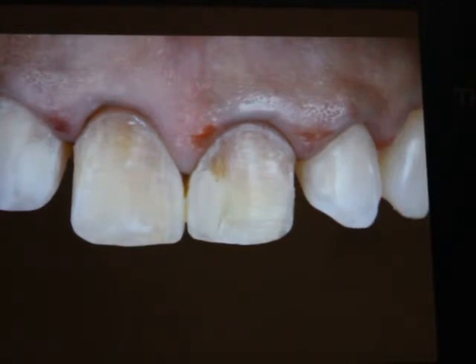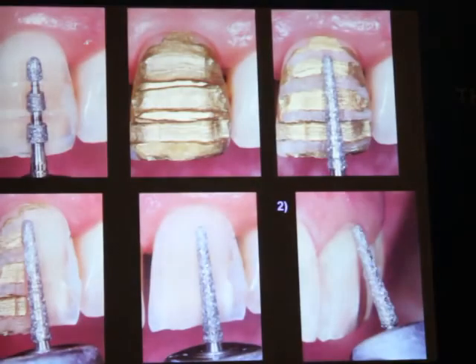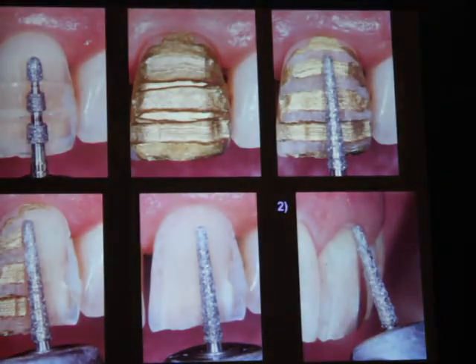And you see here I have a nice preparation, exactly the same quantity of enamel removed everywhere. Thì trên đây là hình ảnh mà tôi đã lấy đi toàn bộ các bề mặt răng chuẩn bị veneer theo đúng kích thước chuẩn. It's the same concept. I put the varnish, I continue like that with the color, easy to control. Đây là cách mà tôi làm. Tôi cũng sử dụng mũi khoan đánh dấu và sử dụng các chỉ thị màu như vậy.